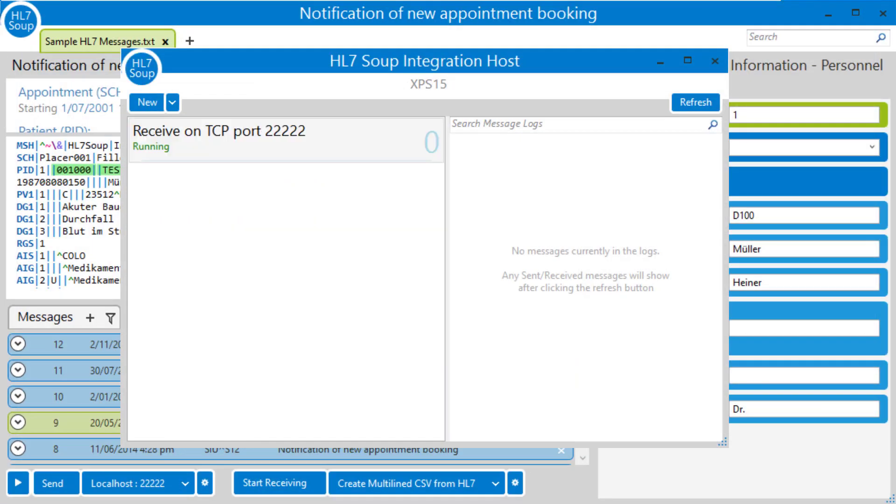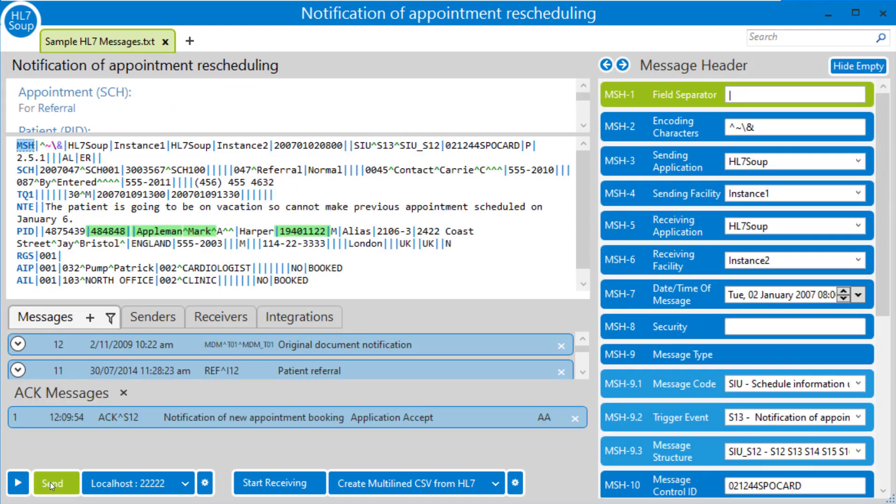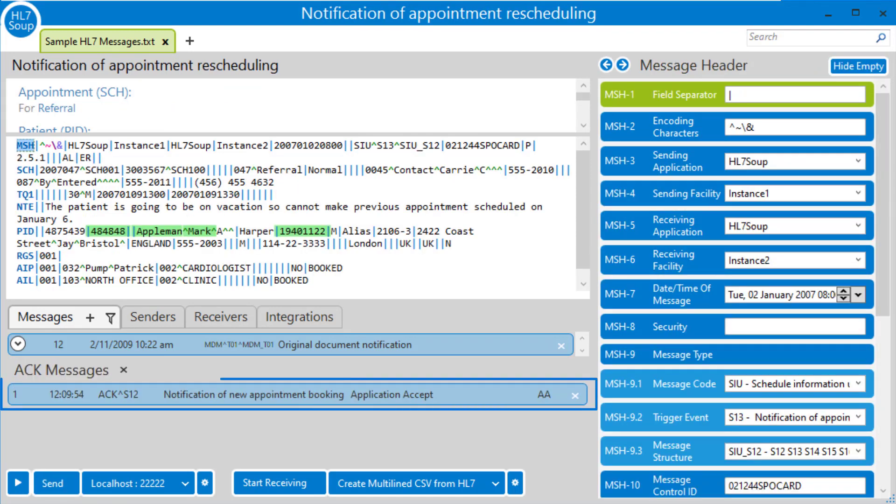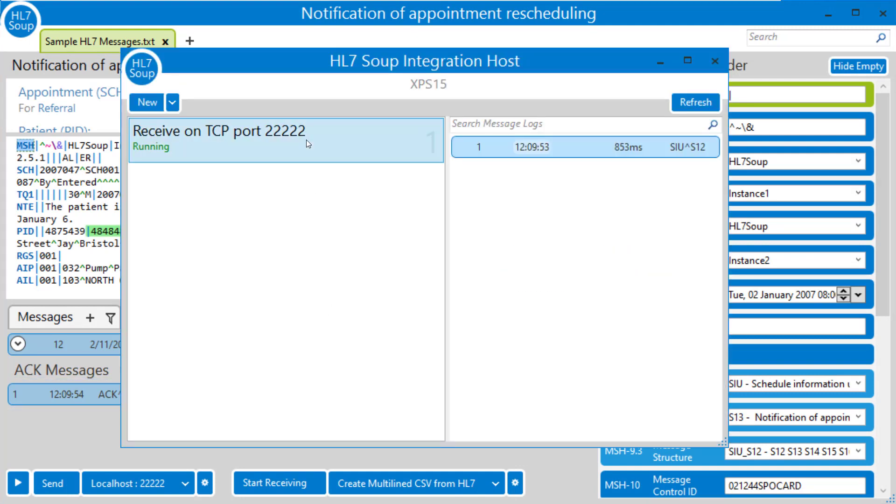So you'll see our workflow is up and running and ready to receive on port 22222. I'm going to head across to HL7Soup. And I'm just going to send through one of these two messages. And we can see it successfully come in. Let's go back into the editor and take a look what we've got.